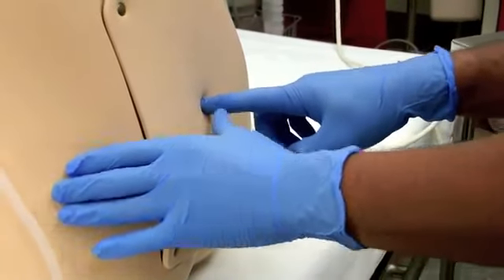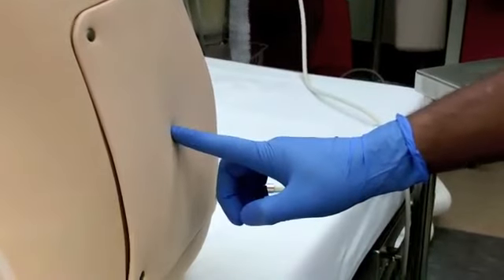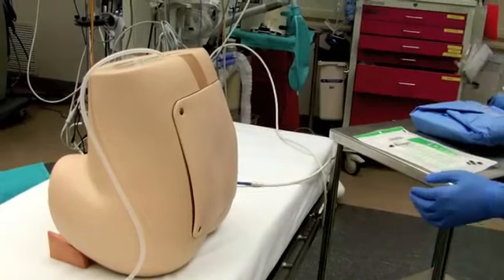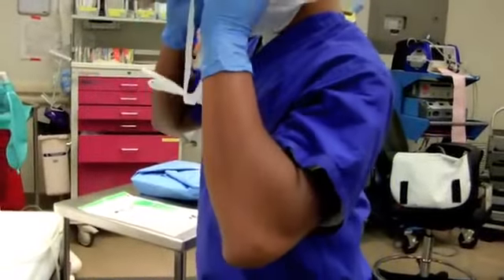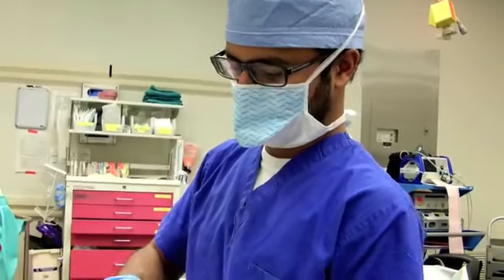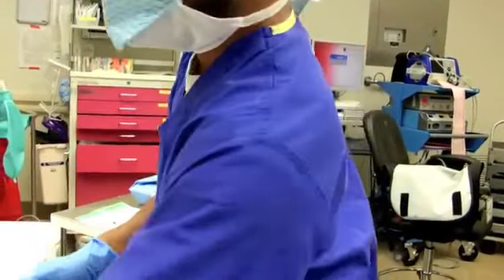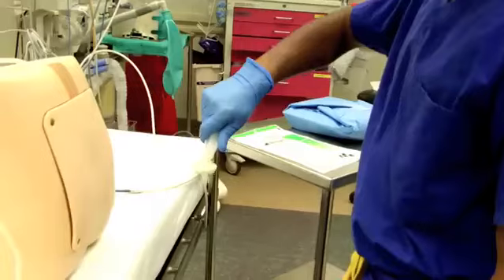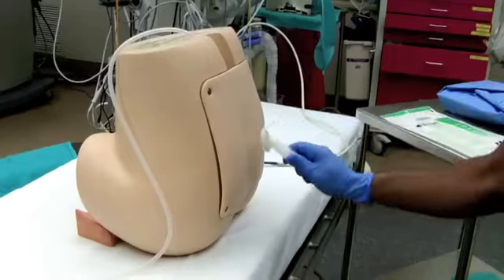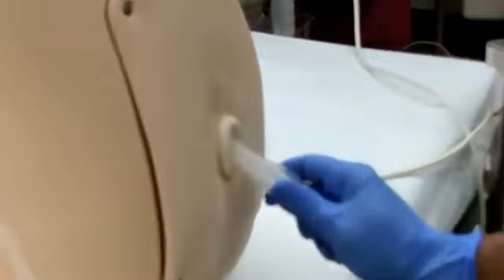Step 4. Clean the overlying skin with chlorhexidine in widening concentric circles. I'm going to put on my surgical mask, open my ChloraPrep, and in concentric circles, clean off the patient's back.